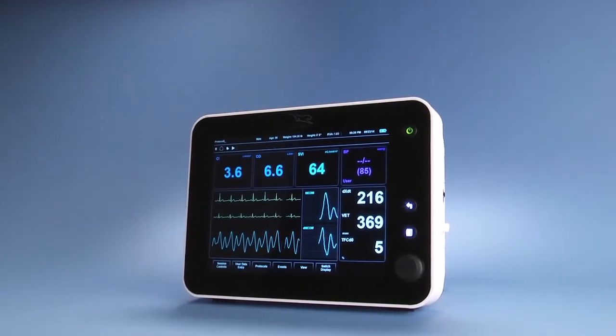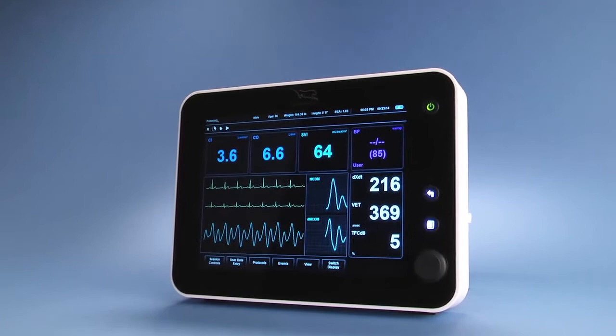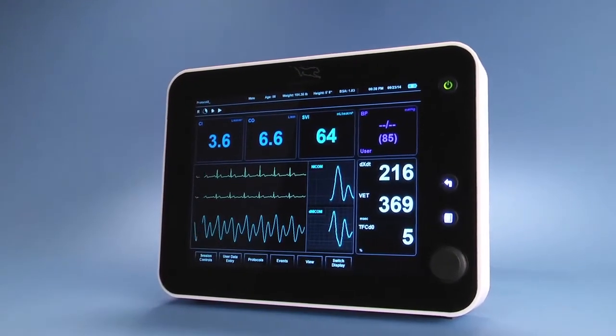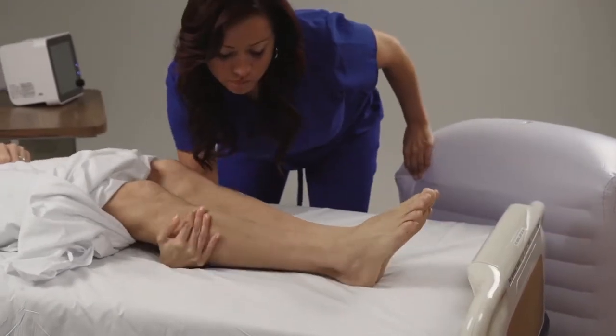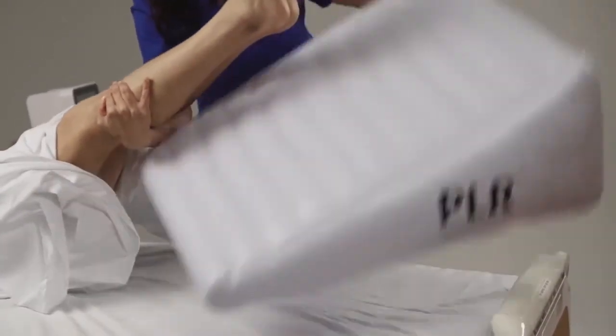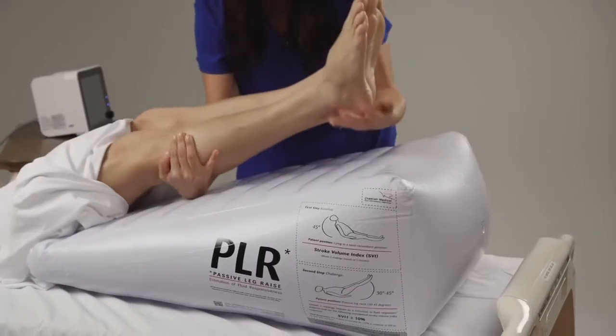With Cheetah Medical's Starling SV, you can monitor hemodynamic parameters non-invasively. Since the fluid challenge can be achieved with a simple passive leg raise, care can be initiated and driven by the nurse.